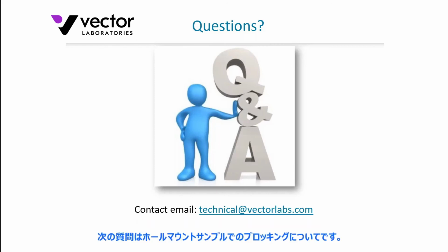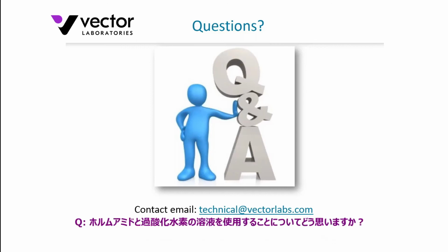All right, thank you. The next question. For quenching whole mounts, what is your take on using a solution of formamide and hydrogen peroxide? It sounds like that will be using a detection methodology with an enzyme-based system. You wouldn't be using that, of course, for immunofluorescence. I have not run that myself personally.